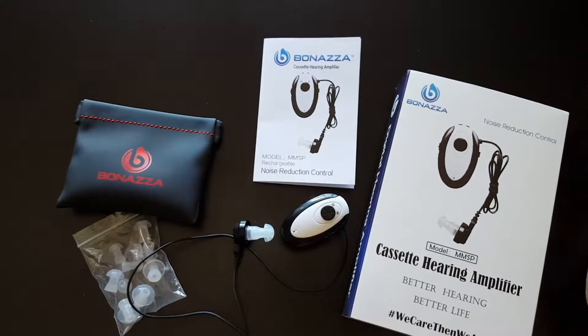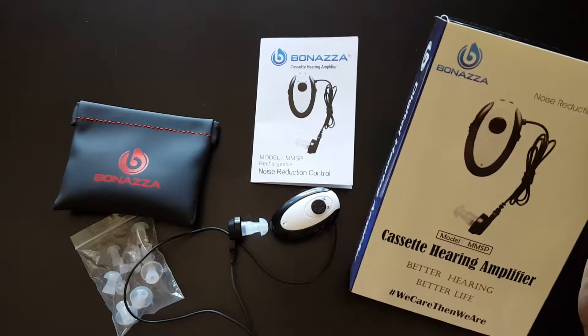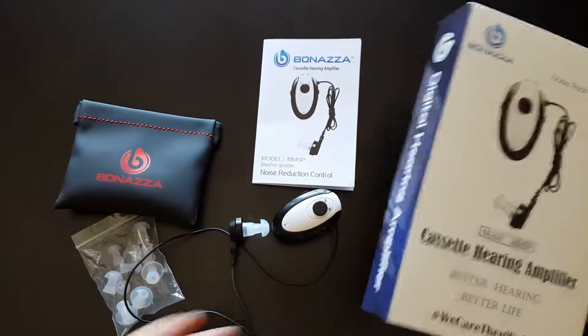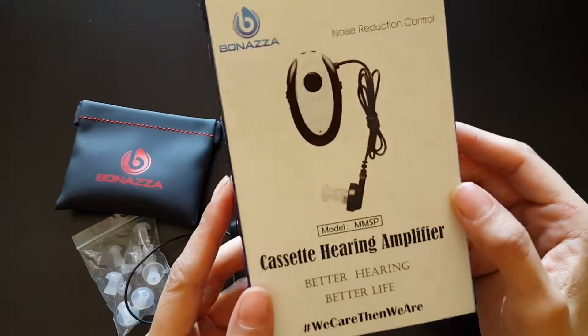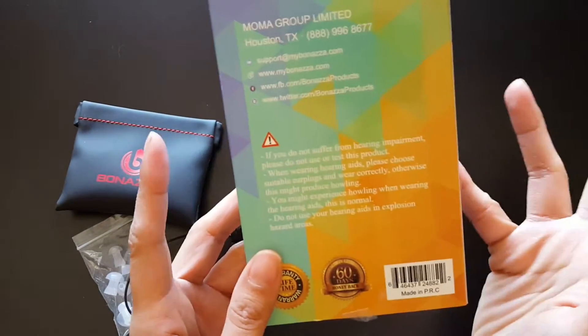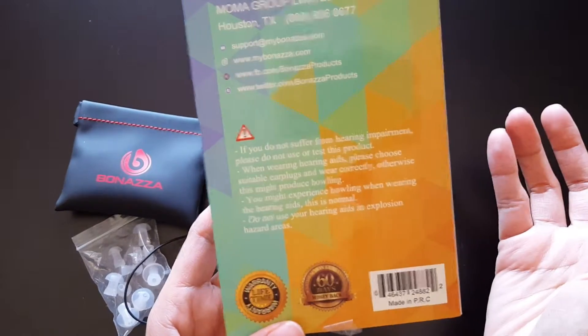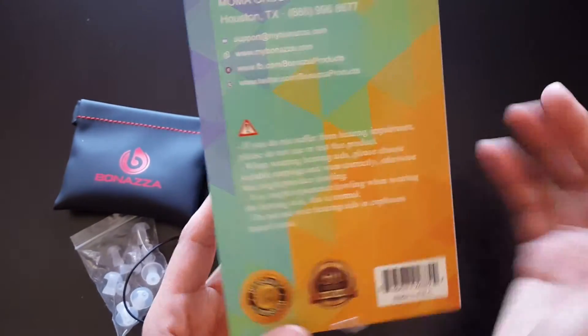Hey everybody, it's Justina. I just wanted to do a quick overview of the Bonazza Cassette Hearing Amplifier — basically a hearing aid to help you hear things a little more clearly. Obviously if you don't have a hearing impairment, you probably don't want to use it, because it can be a little loud and it goes directly into your ear.